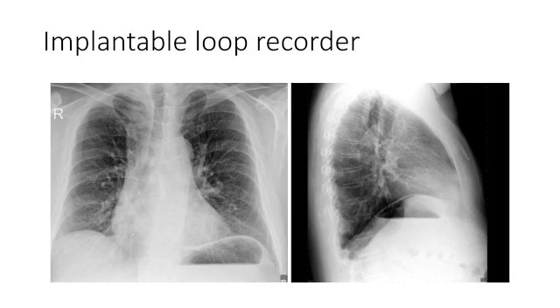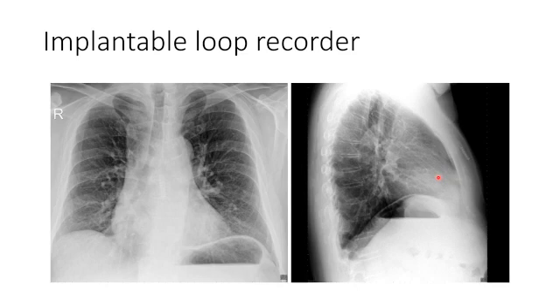The next cardiac device is the implantable loop recorder. These are small insertable devices that continuously monitor and record cardiac rhythms. On the AP view you can see it, and on the lateral view you can see it subcutaneously. They are placed subcutaneously and used for the evaluation of patients with recurrent unexplained episodes of palpitations and syncope.